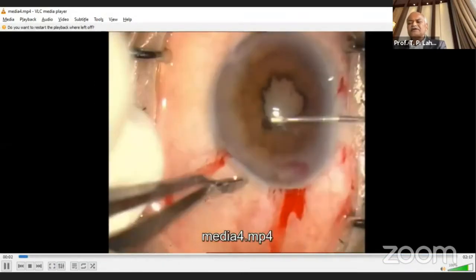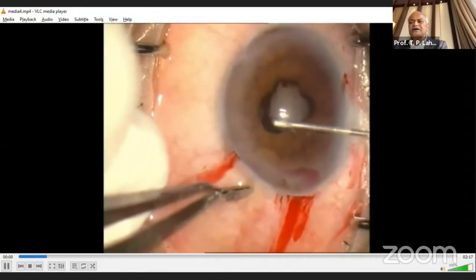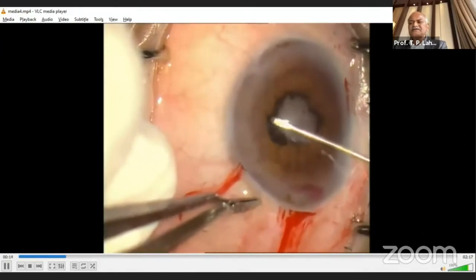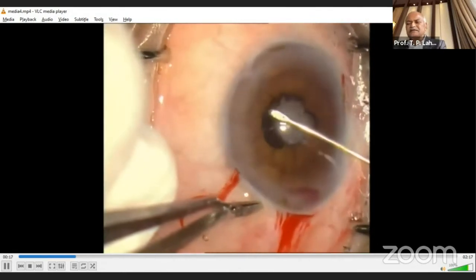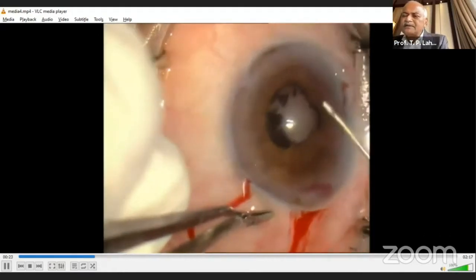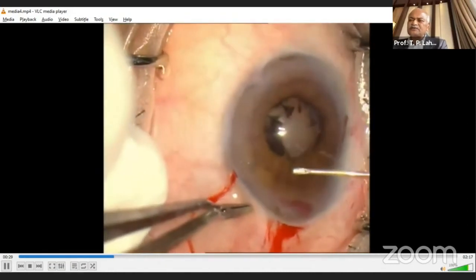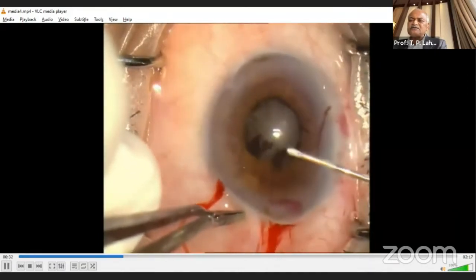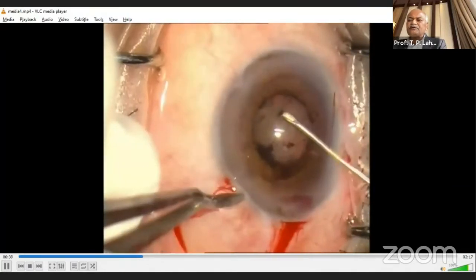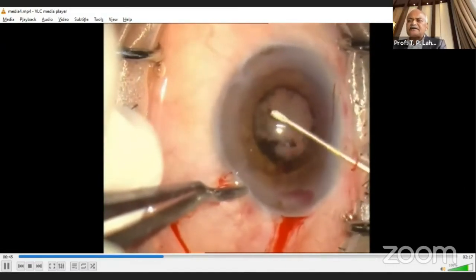Now I'm going for the small pupil. You will see here, the posterior synechias are there. I'm trying to break the synechia in the case. So here I'm using the needle. Whenever we are using the needle here, we also have to take the precaution that the anterior capsule should not be torn by the needle. So whenever you are using the needle, it should be on the iris side and not on the lens side. Like that, you can just pull the iris so that the synechia can be broken. And the pupil, which was very small, is now enlarged and slightly semi-dilated.